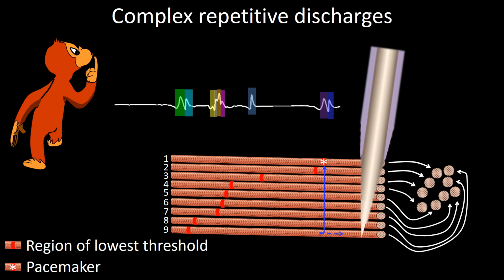In this frame, I have drawn a transverse cut of all the fibers arranged in a group, which is how they are in normal life. Hence, fiber 9 and fiber 1 are abutting, so the electrical activity as illustrated in this frame can ephaptically be transmitted, as represented by the small blue arrow indicated in this frame. Yet, questions remain that have received logical but unverified answers.